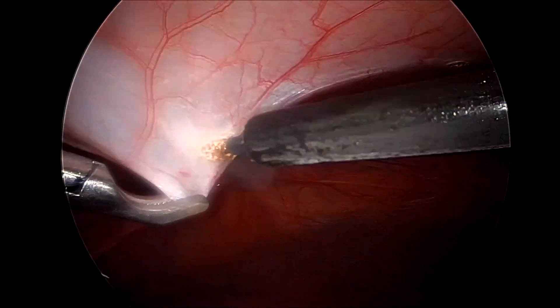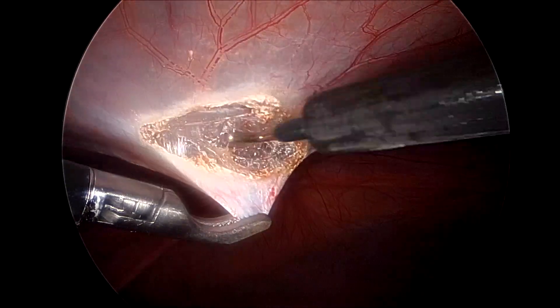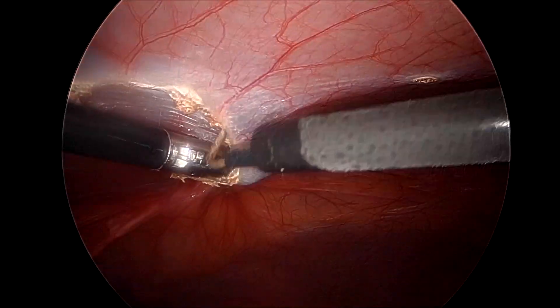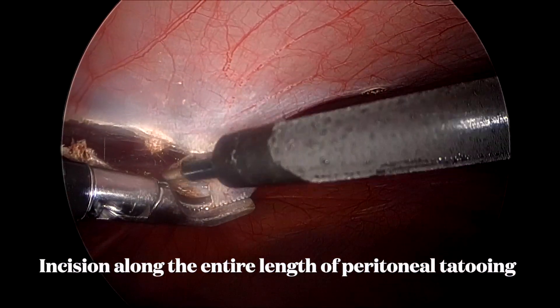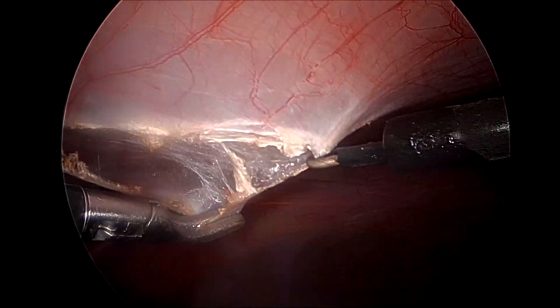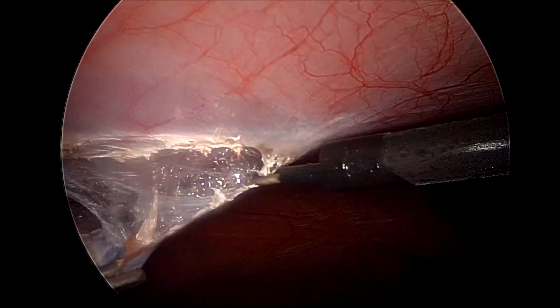We place ports onto the left side as laterally as possible under vision. Under external guidance we make tattoos onto the peritoneal surface along the intended line of incision. We start the incision at the level of umbilicus and use a Maryland forceps in our left hand and a hook or scissor in our right hand.